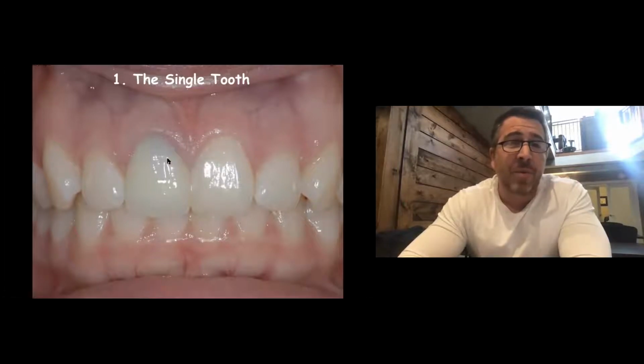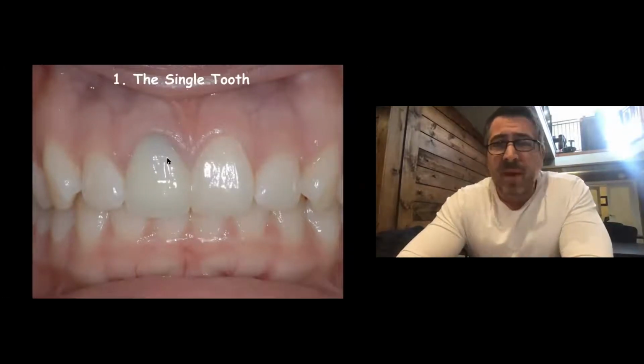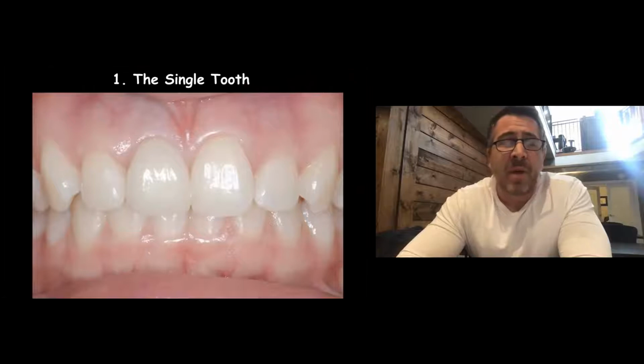She just wasn't happy with the gray that was showing through the tooth, and she wanted to extract it and place an implant. We extracted the tooth. We did the same-day implant, same-day temporary crown, and then transitioned it into a final crown, and resulted in a result like that she was pretty happy with. And to me, that's a successful result.